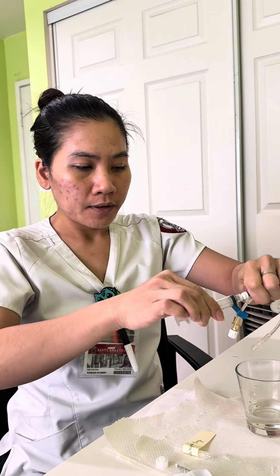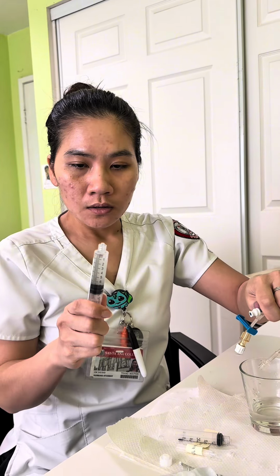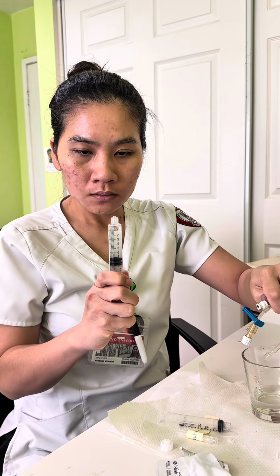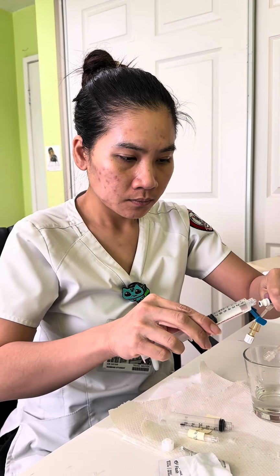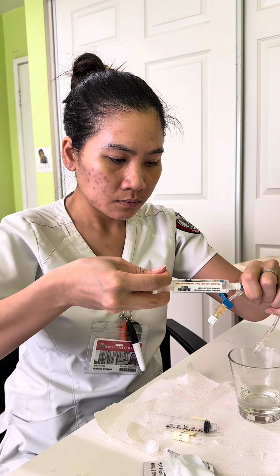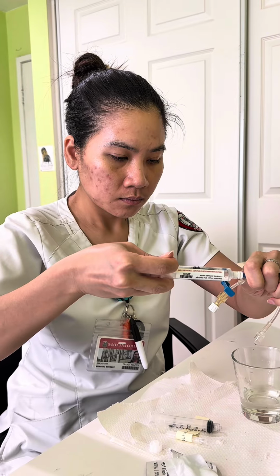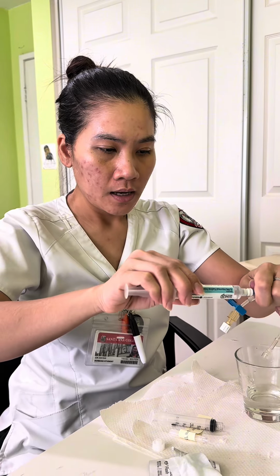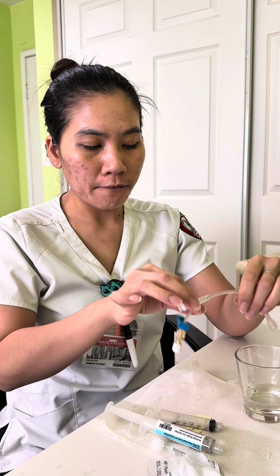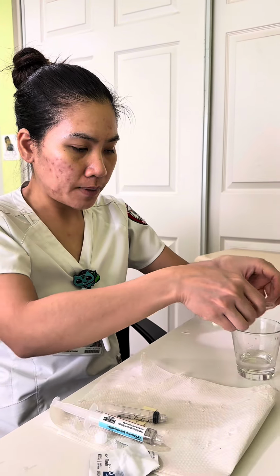Okay, after giving all the medication, I go ahead and flush the tube one more time. The patient doesn't have any sign of redness or discomfort, so I go ahead and remove all of my belongings out of the patient room.